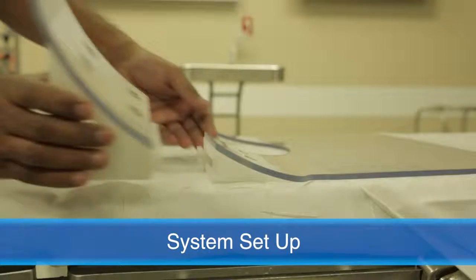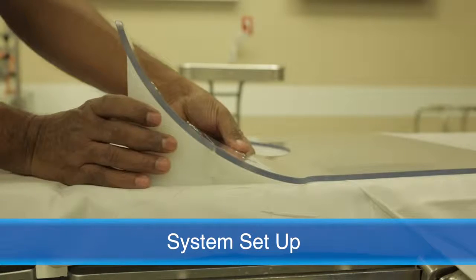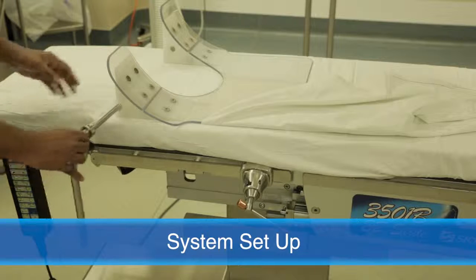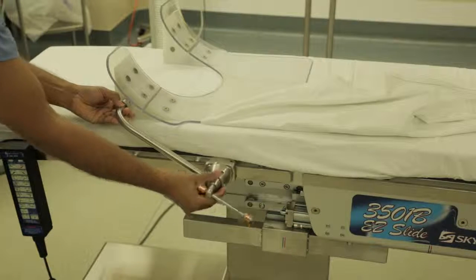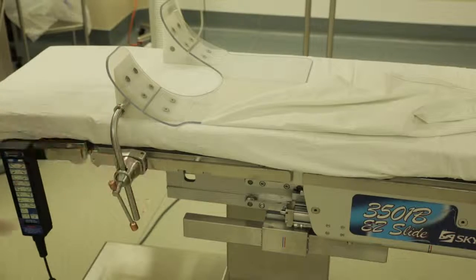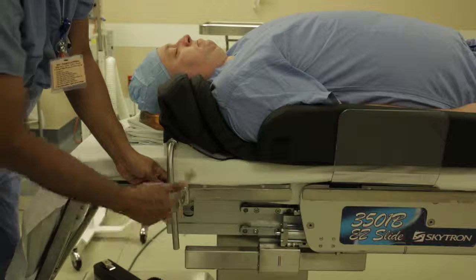Slide the TPS stabilizer wedges onto the TPS foundation, making sure the wedges are properly aligned. Place the shorter side of the TPS stabilizer posts into the holes on the stabilizer wedges. Then place the other end of the stabilizer posts into the table clamps and tighten. The clamps feature a round post tip that fits any North American surgical table.